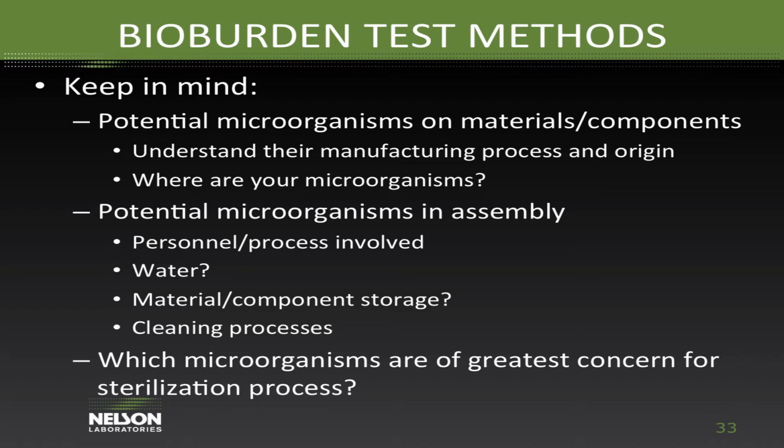So when we are setting up a bioburden test method, and this is something that at Nelson we're trying to do more often, we're trying to make sure that we dig into some specifics regarding your situation to help you better establish what the right test method is for bioburden. So things to keep in mind. What types of microorganisms might be on your materials, your raw materials, or your components? And in order to do that, we have to understand your manufacturing process.